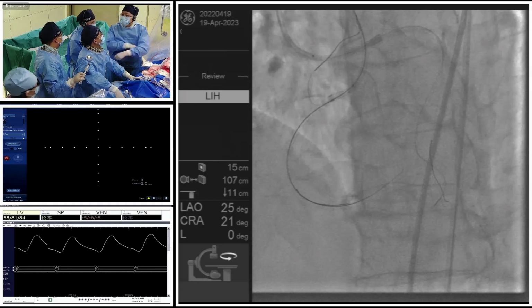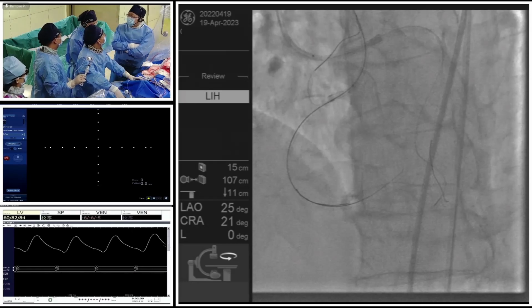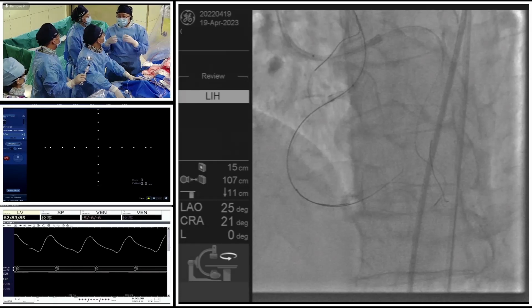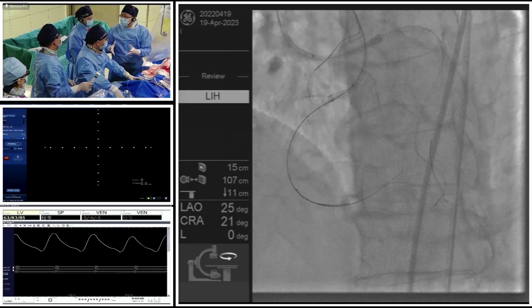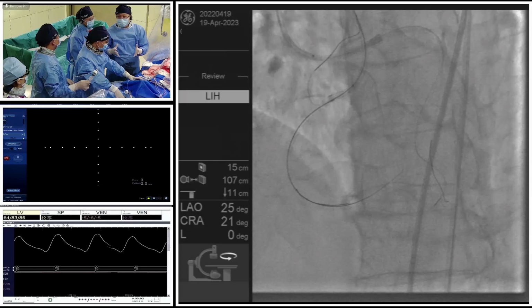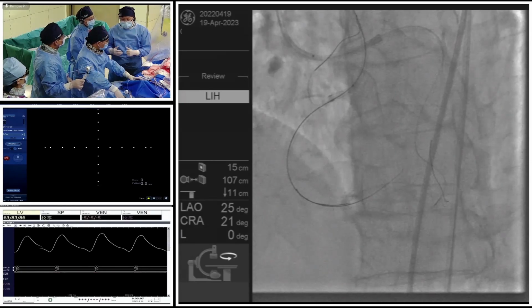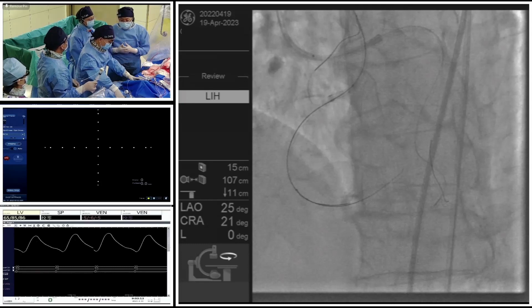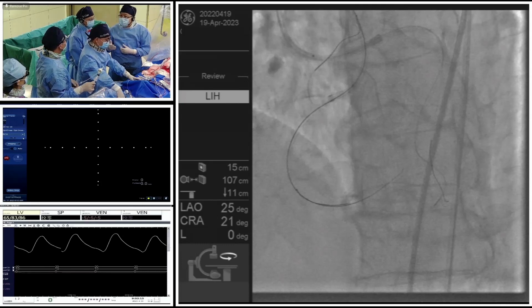The next case should use the Shockwave system, and we will use a China-made special imaging machine that integrates OCT and IVUS to better see the calcified lesion. So at present, imaging guidance is really very, very important. We must make full use of imaging and functional guidance.